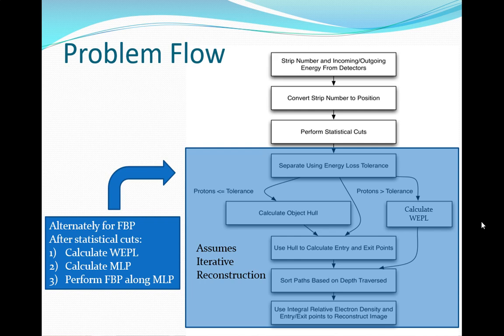There is a group out of Europe that does filtered back projection, right? There are certain benefits to that. The number one thing for theirs is it's really stupidly fast. The problem is that it's got a lot more artifacts and other problems that we can avoid. And we can do all kinds of other funny, cool stuff, and that's usually more of our concern. But there's a place for each. So I don't want to say no to one of them.